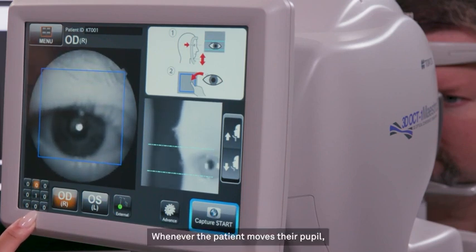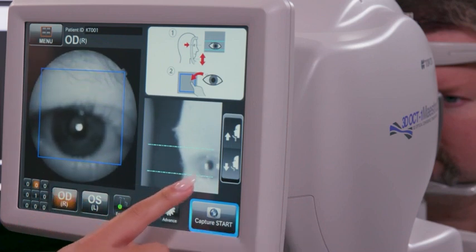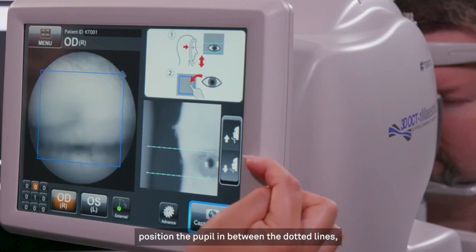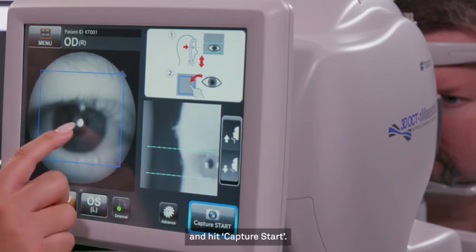Whenever the patient moves their pupil, adjust the pupil using the light blue lines on the right and by clicking the center of the patient to align the pupil for the next new fixation point. Just like before, position the pupil in between the dotted lines and within the big blue box and hit Capture Start.